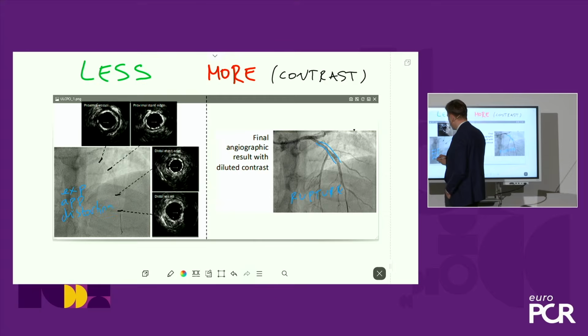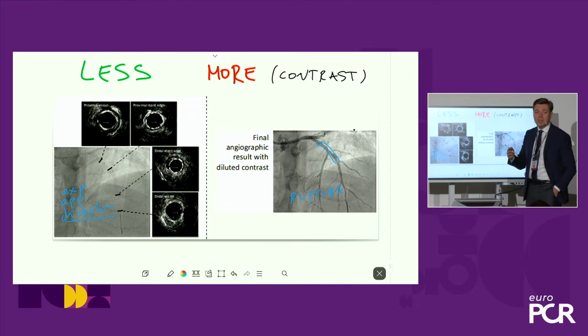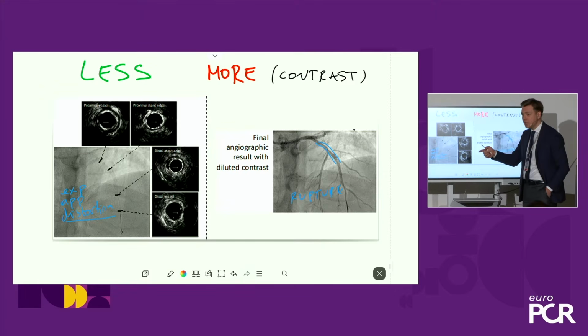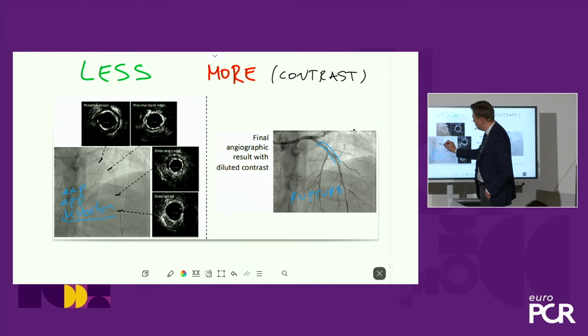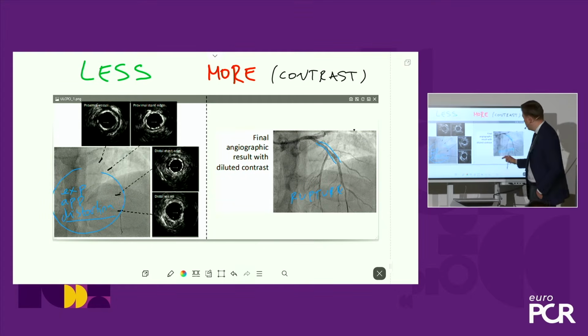When I say distortion, a recent intracoronary imaging guided trial in bifurcations showed that 20%, 18 actually, but close to 20%, have a distorted stent in the left main, which was seen on imaging, and of course you cannot see it on angio. So all of this you see with imaging. And you see here, of course, the rupture.